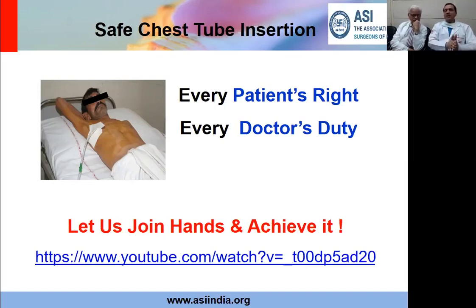This is a fundamental mistake done by a large number of people. The lung will be collapsed and they will put talc inside the chest. Oh, we have put talc to do pleurodesis. Friends, pleurodesis is adhesion between parietal and visceral pleura. If the two pleurae are not in contact with each other, no pleurodesis can take place.